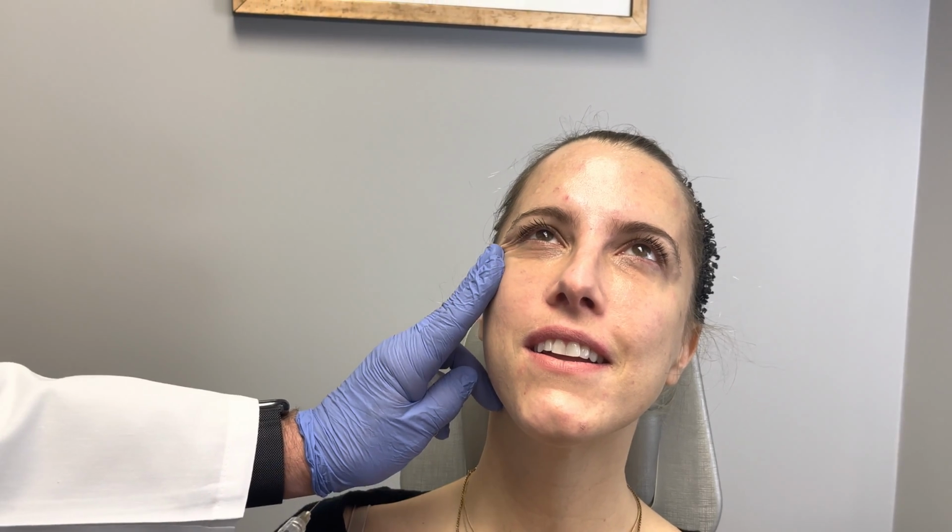And she's going to go right back to the office after this, which is nice. And you can see immediately, just that little bit, how it makes a difference. Here, you can see too, see in the mirror? See how it gives you a little more of a volume here? Yeah, distinction. And you're flatter here. So I'm going to do a little bit more. You can hang on to the mirror.